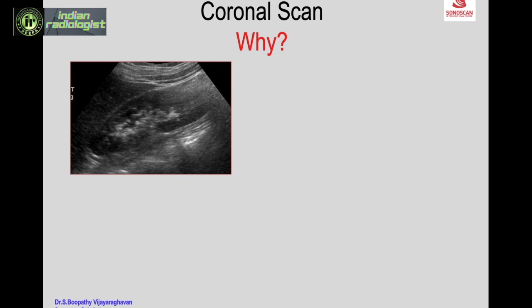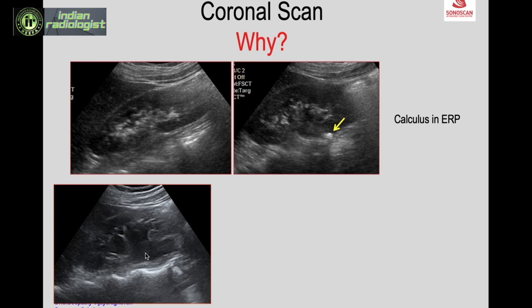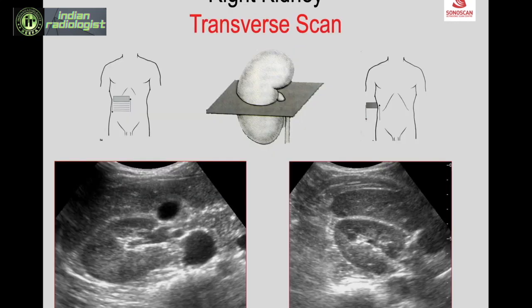On coronal scan, a kidney that looks absolutely normal on sagittal scan may reveal a calculus medial to it — a non-dilated renal pelvis with a calculus at the pelviureteric junction (PUJ), missed on sagittal scan. Additionally, hydronephrosis with the renal pelvis appearing to end blindly may suggest PUJ obstruction, but tilting the probe in a coronal plane anteriorly reveals the pelvis continuing as a dilated ureter bending and turning upwards — the seahorse sign, very characteristic of retrocaval ureter.